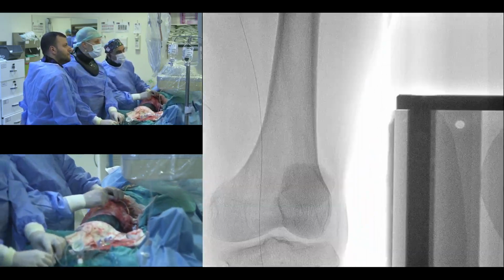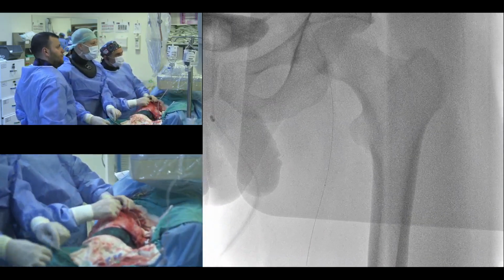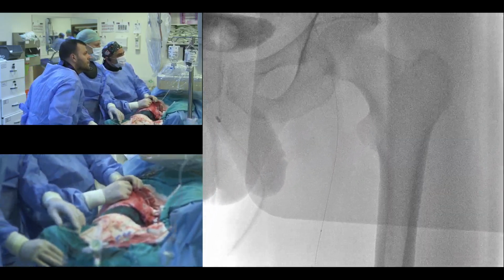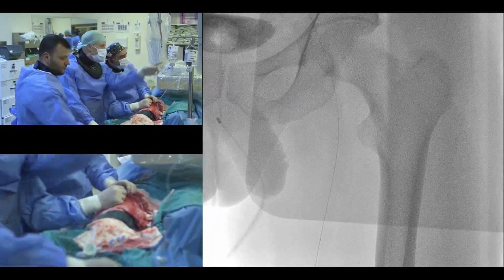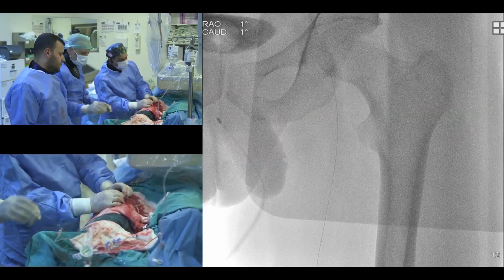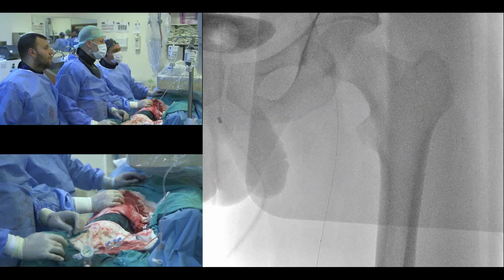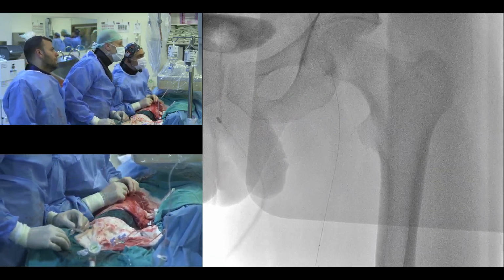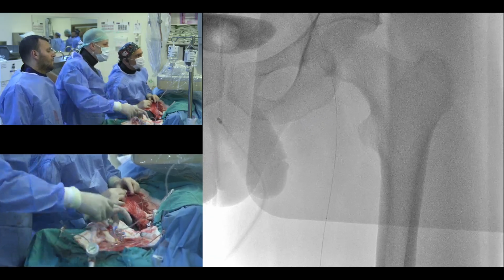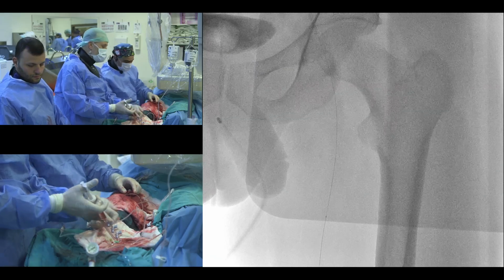He goes home. A year later, he comes back, and he says there was significant improvement when we opened, but now he has started having right calf pain again. If he sits down, it gets better, denies rest pain. Blood pressure was running high. As I said, he didn't like taking medicines. And we did an arterial duplex: 100% occlusion of the distal right popliteal artery, proximal ATA, TP trunk, and the posterior tibial. ABI is again miserable on the right, left looks good.